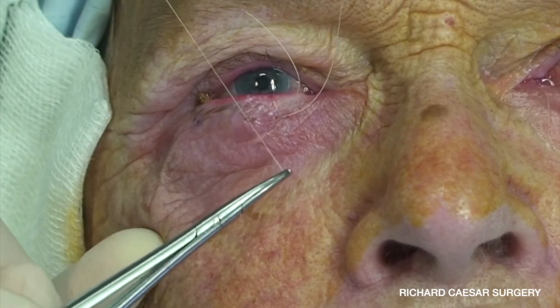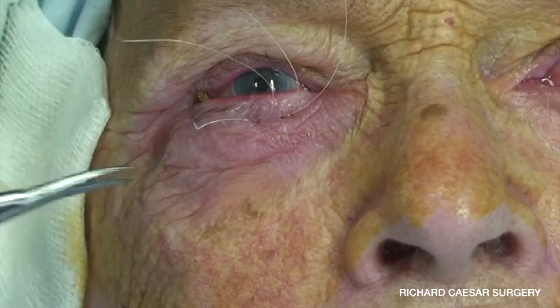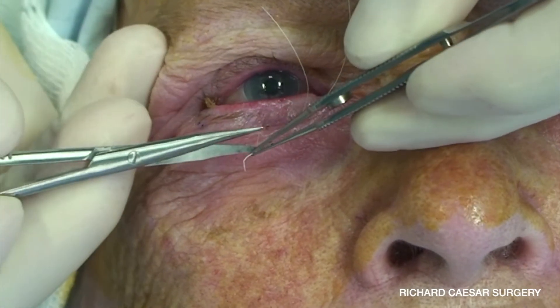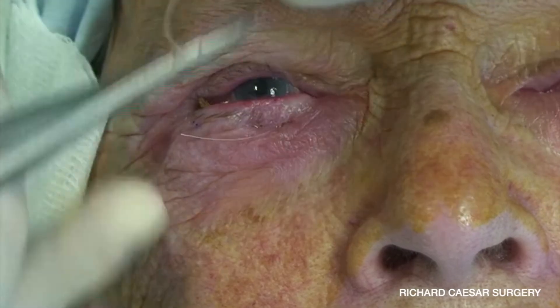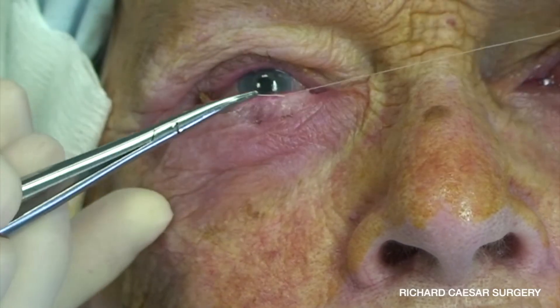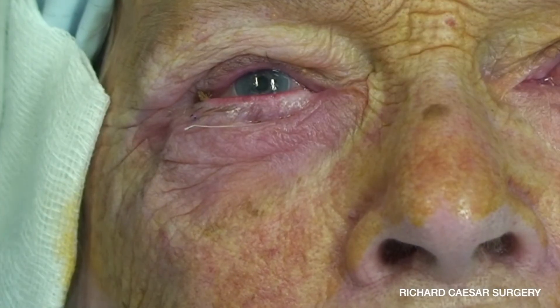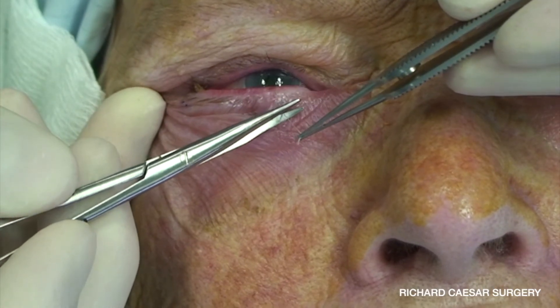These little knots are dropped into the stab incision and you don't need any further suture to the skin — they will simply drop back and the wound will heal over the top. It's this absence of any sutures to the skin which makes this a procedure where you can follow up your patient with a phone call. There are no sutures to remove, and the key question is simply whether the eyelid has stopped irritating the patient, saving them a trip to hospital — which in these coronavirus times is a good thing.